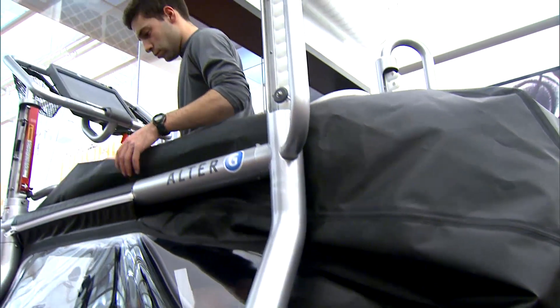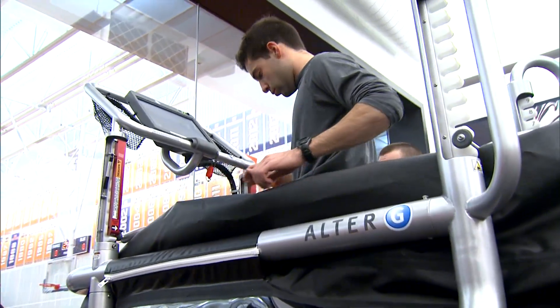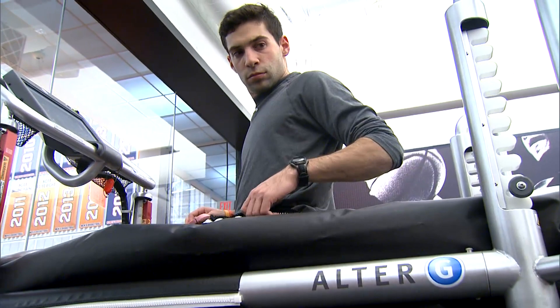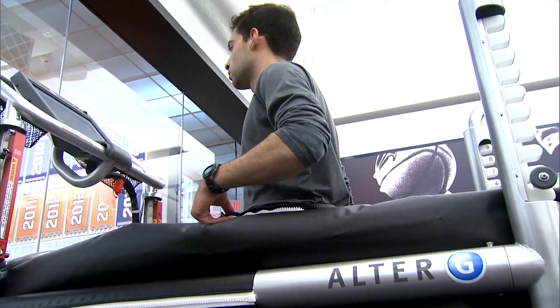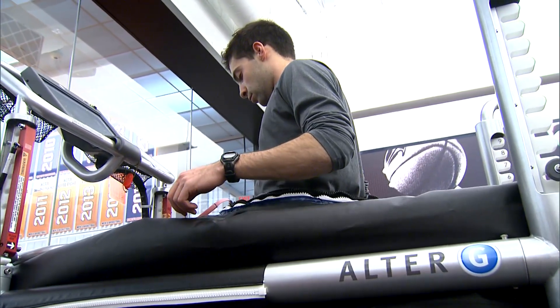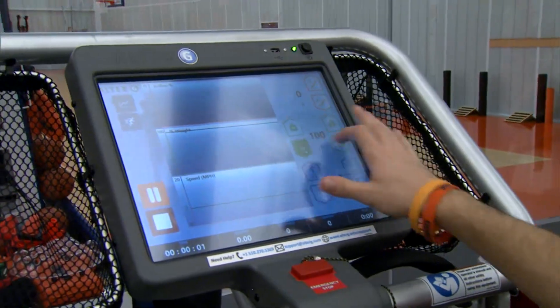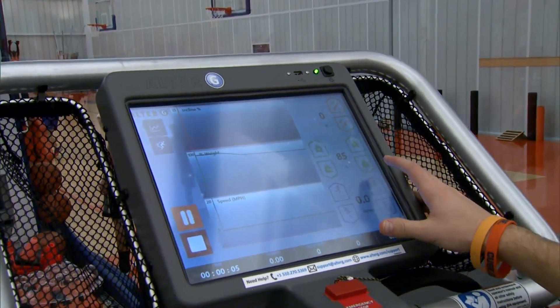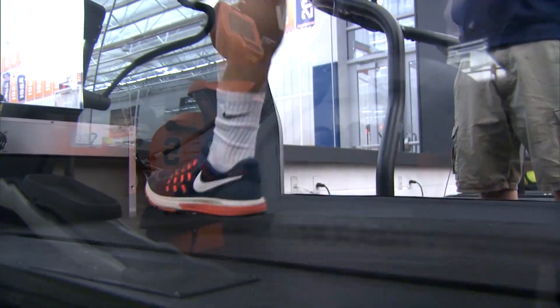What this does is it inflates to a certain percentage of what we set for him. So right now he's running on about 85% of his body weight, so it's lightening the load so we could actually get a little bit of contact on the treadmill, but at the same time not getting that full pounding of 100% and gravity weighing on him. We could adjust the speed with this — he could go down as low as 20%, 25%.